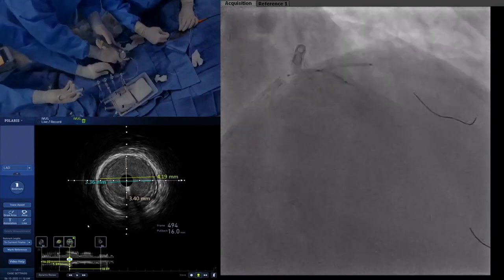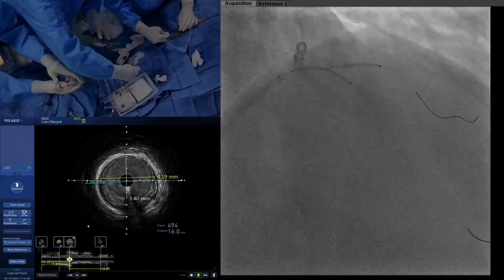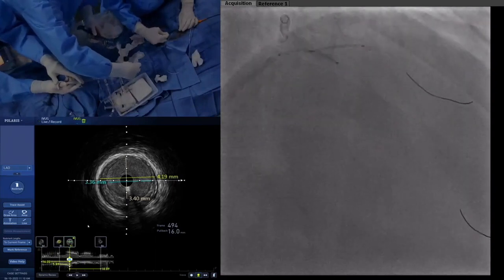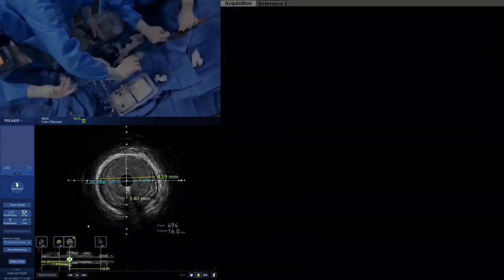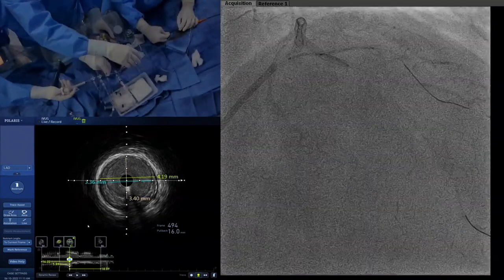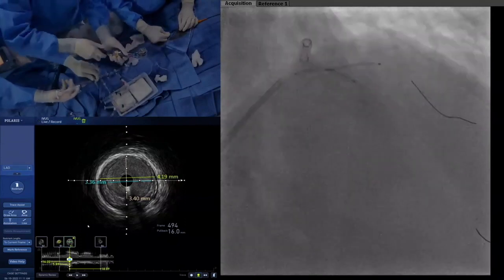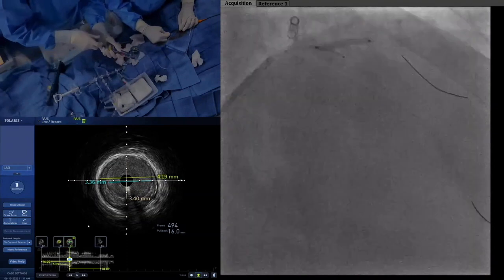I think the important thing is, all of these discussions, whether to stent or try provisional on the side branch, whether to nail the ostium or go into the left main, we don't have hard data on any of these things. Of course not. Never have hard data. I think they're all fine. So we are going up, but with the diag. You are just okay. I don't want to miss it.